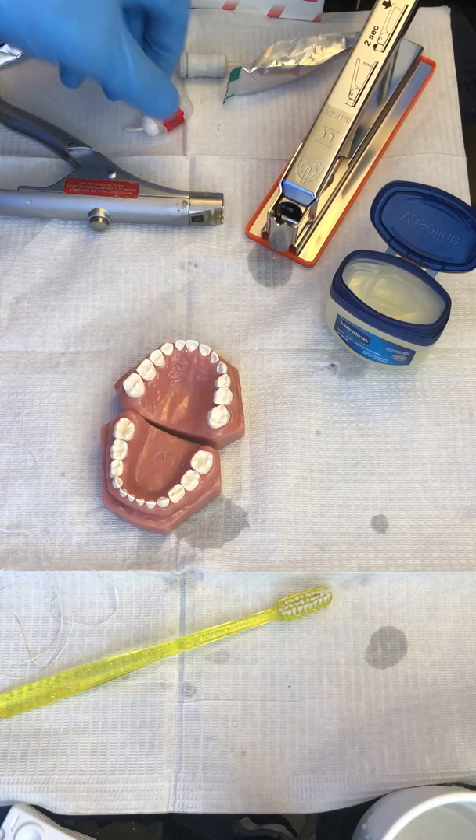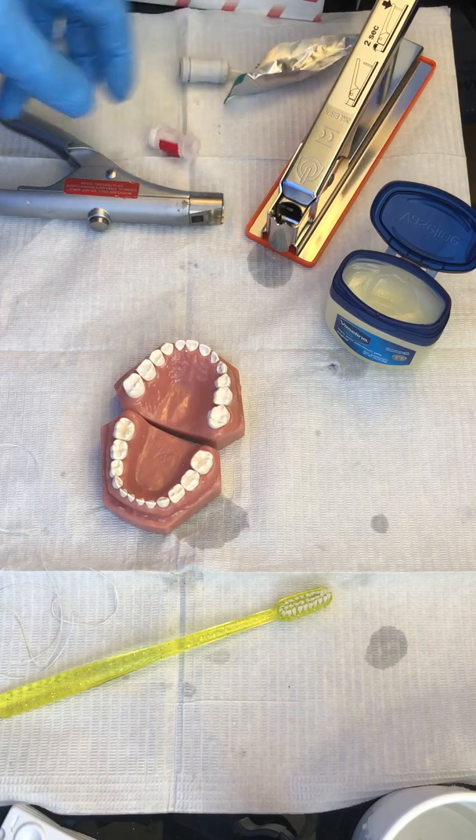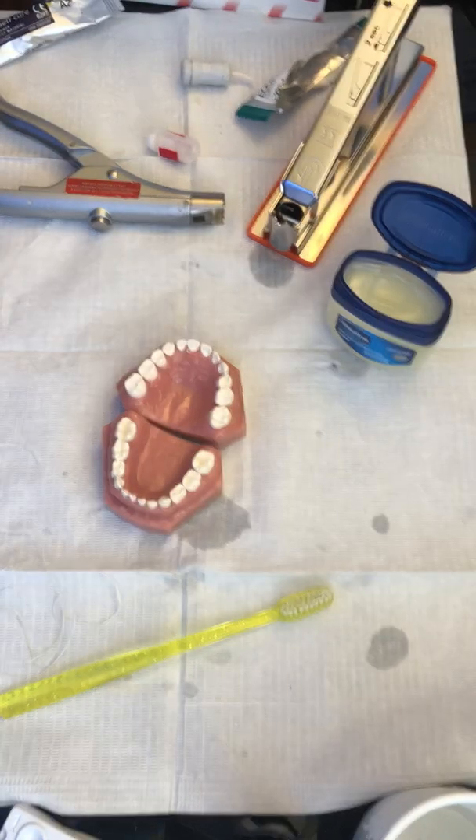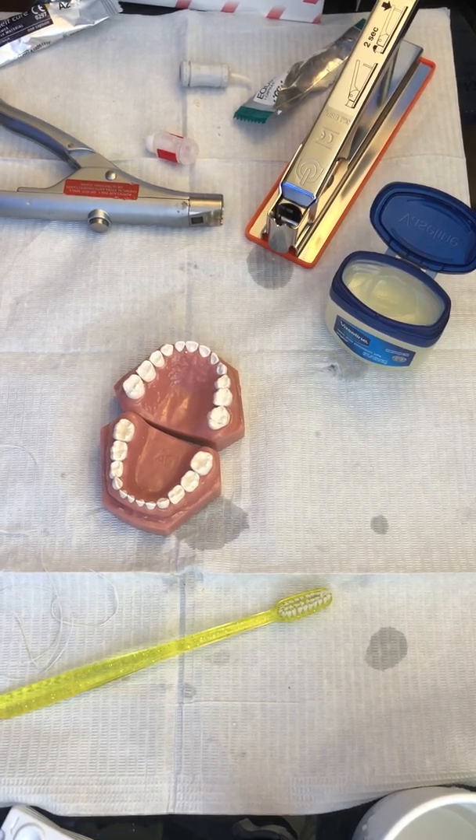You'll notice that material was a little softer than the others. Of course if you use the Ketak Universal or the Ketak Molar it would be much more similar in consistency to the Riva Self-Cure or the Equia Forte.